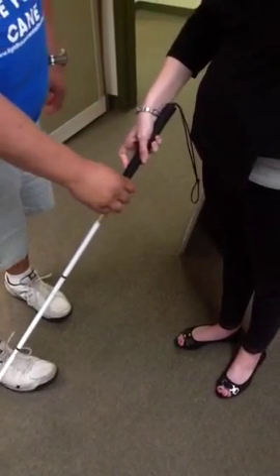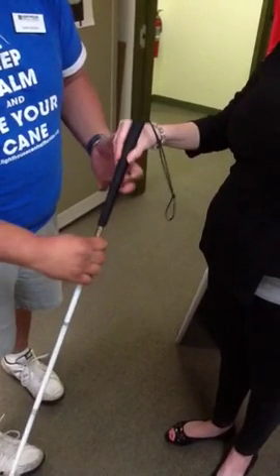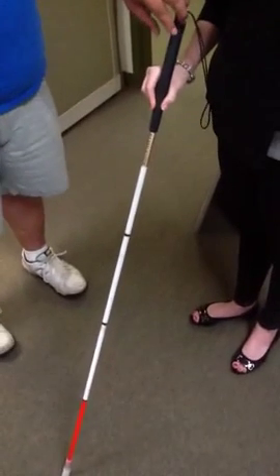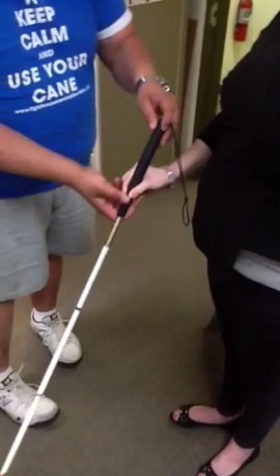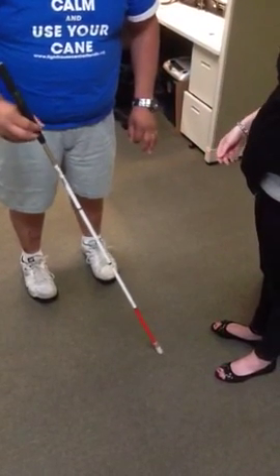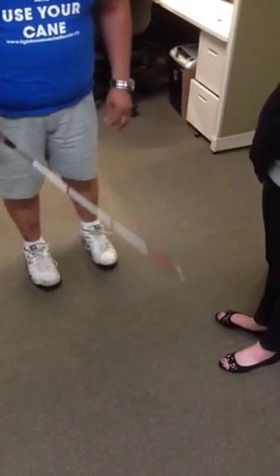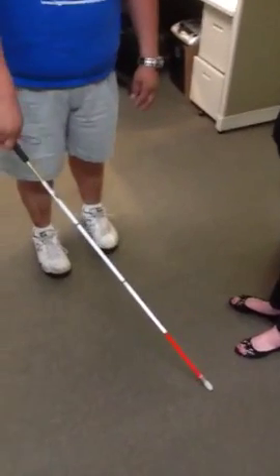Then the last one is I want you to hold your cane like a pencil, like you're writing with a big pencil. You want to get closer to the center right here. This is called a pencil tip grip, and the pencil tip grip is just used for sensitivity purposes. So you have your pencil tip grip like you're holding a big pencil. You have your finger so it goes back and forth. It rotates in your hand. Then you have your thumb grip here.